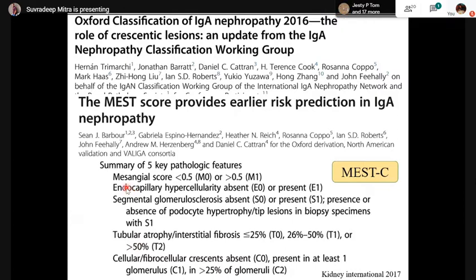M for mesangial hypercellularity, whether that is present or not, because I have said that IgA nephropathy can show you any morphology. Please remember that IgA nephropathy can show you absolutely normal morphology, and you can only detect the disease by doing a direct immunofluorescence. There is no other way. So mesangial hypercellularity, if it is there, is usually a poor prognostic marker, number 1. Segmental glomerulosclerosis, Dr. Debashish has already taken you through FSGS. Please remember that FSGS kind of morphology can also be seen in IgA nephropathy, and if it is present, usually the patients tend to progress more towards renal failure.